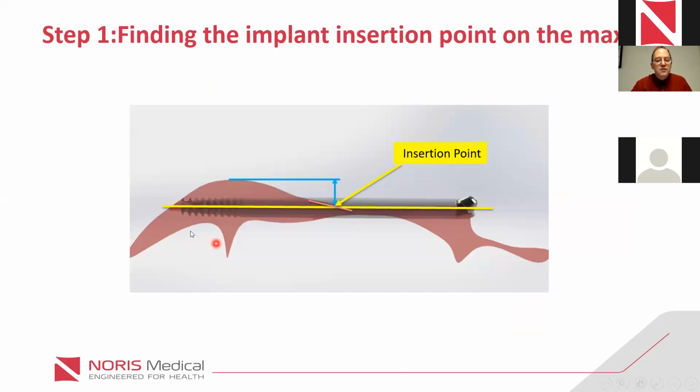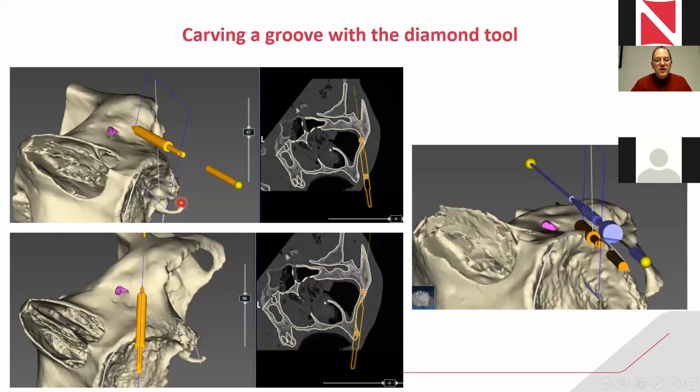Okay. We see here that when we come to this position, we have the apex of the implant anchored in a cortical bone. If we did not go all the way through, we wouldn't know the distance. Now we have a measuring tool.